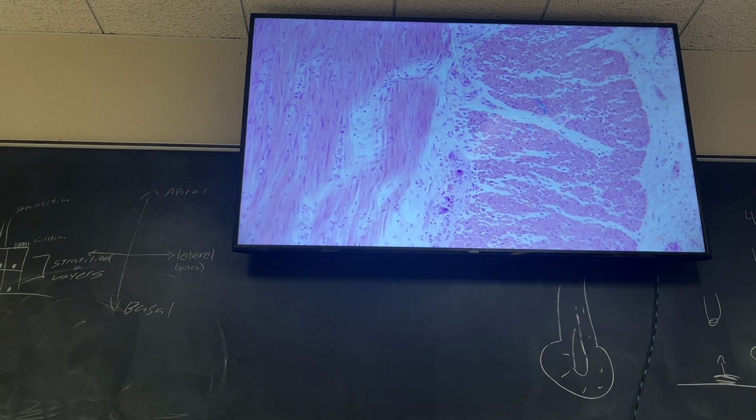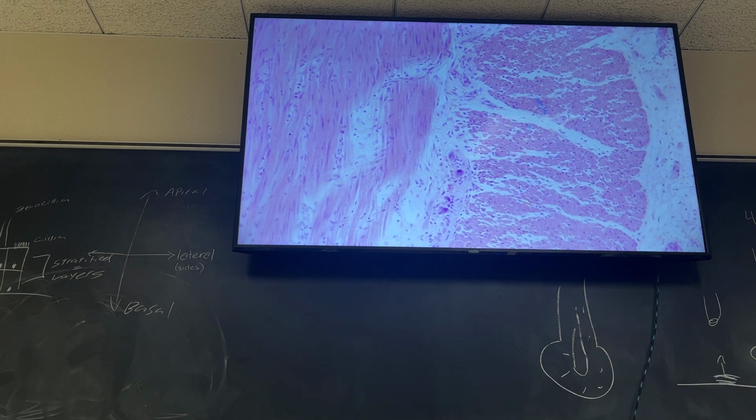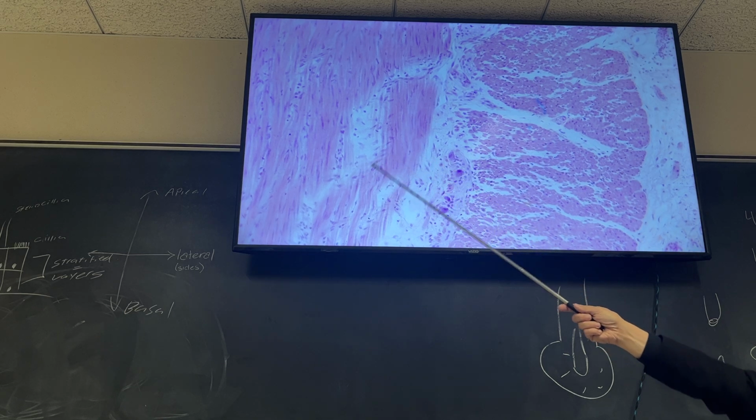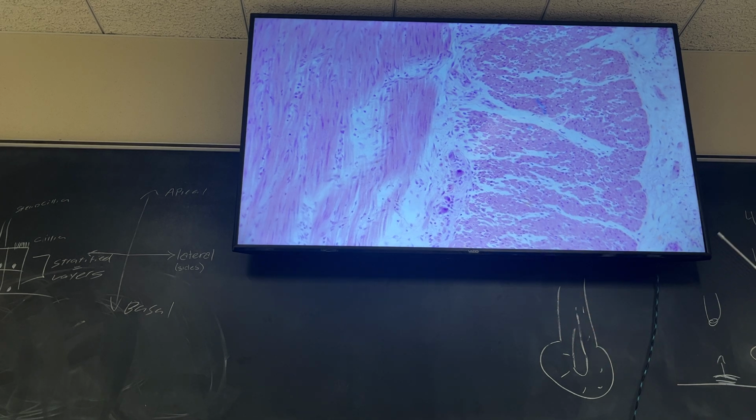So those are nerve endings, or encapsulated nerve endings, housed between the two smooth muscle layers, right? So what do you think their job is? To make them contract. They're controlling the contractions of these two layers of muscles, right? And we'll talk more about them as it goes. But that's just one example of where some of these terminal ganglia are. There are lots of them in your body. That's just a really easy one to spot.